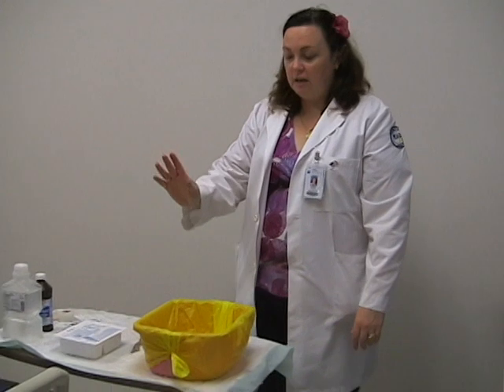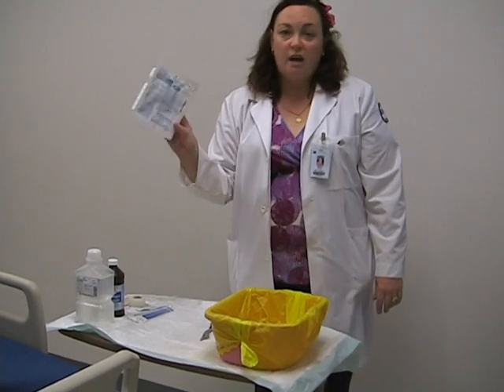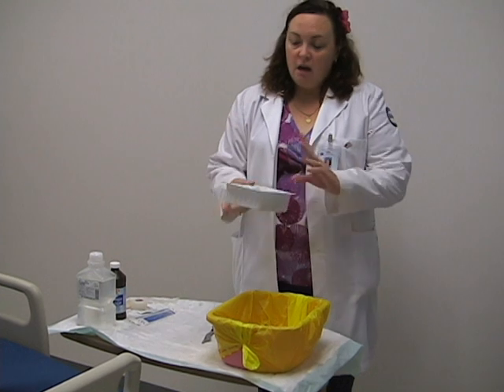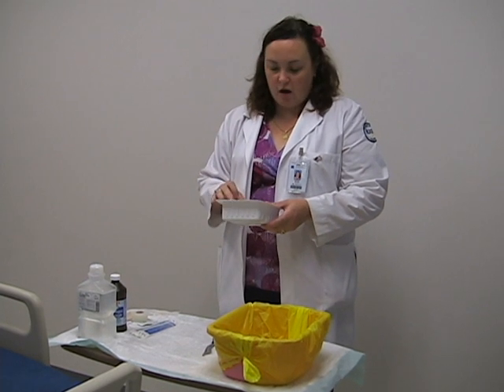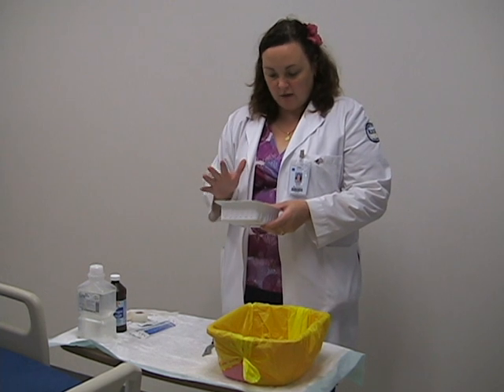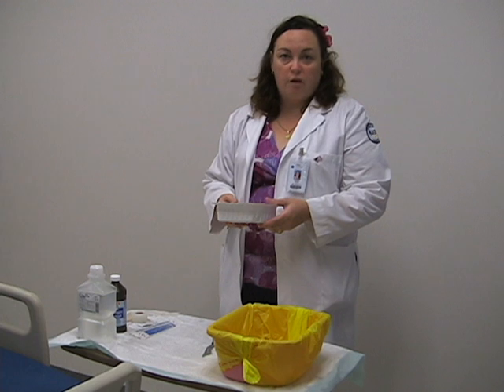Here in the lab we will be using the following equipment. We need a biohazard disposal. We're going to use a tracheostomy care kit — these come commercially prepared. Please make sure you look at the contents to make sure that everything is in there that we need. This kit has trach ties, pipe cleaners, gauze, sterile gloves, and two basins for soaking purposes.